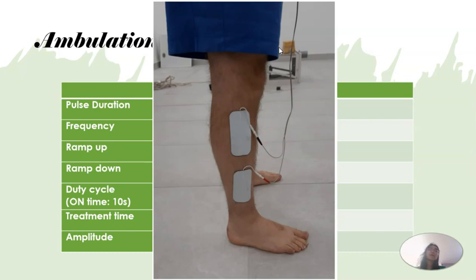Greater current amplitude would mean na mas mabilis ma-fatigue yung muscle. Since ang treatment time natin dependent dun sa muscle fatigue, gusto natin na ma-target yung motor point para kahit konting milliampere lang, or kahit konting electricity lang yung ina-apply natin, nakakapag-produce ka na kagad ng contraction.